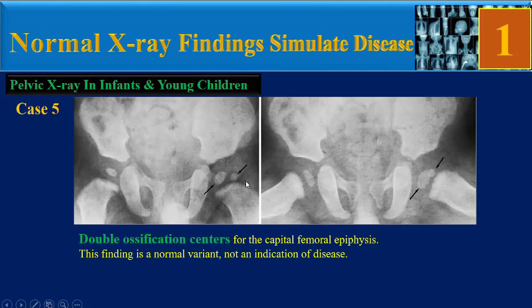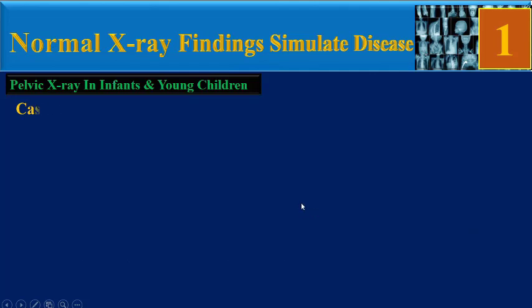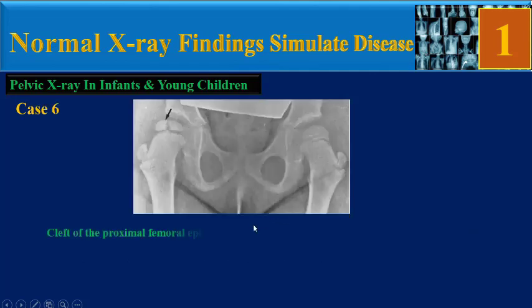Case 5: double ossification centers for the capital femoral epiphysis. This finding is a normal variant, not an indication of disease.